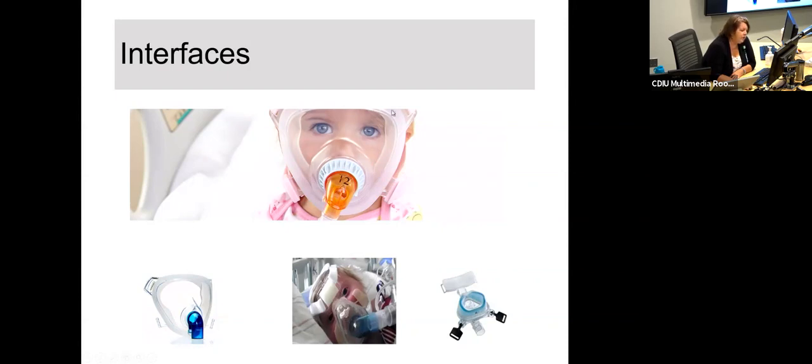And we often use these types of masks. They are called different things, but a total face mask is one of the most common descriptions. And then for those of us who are in the business, we'll refer to this as the scuba mask or the firefighter's mask.